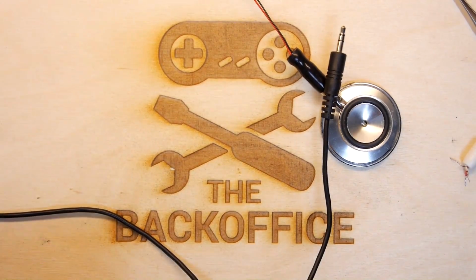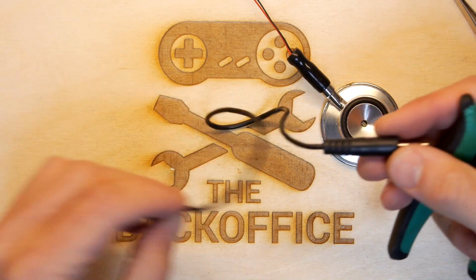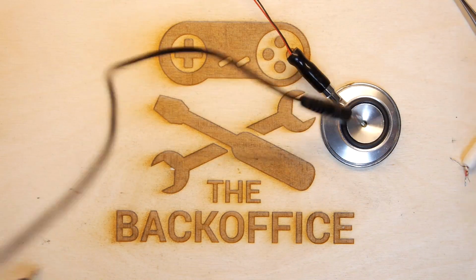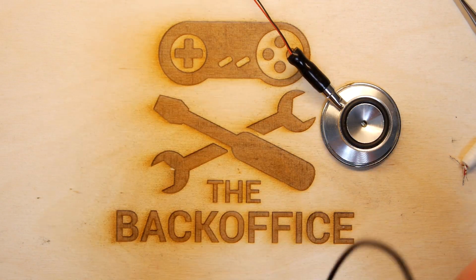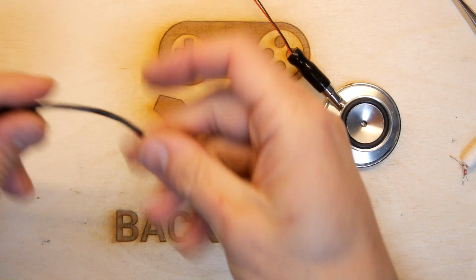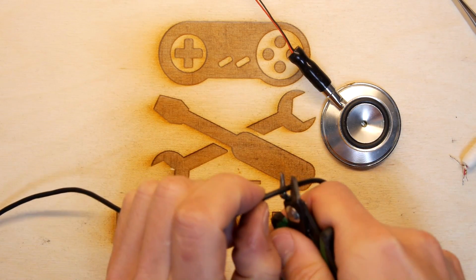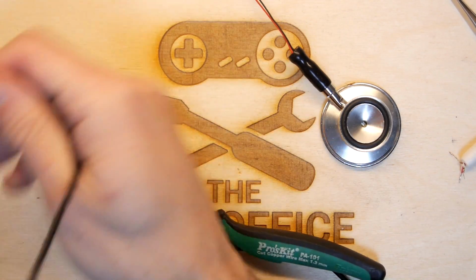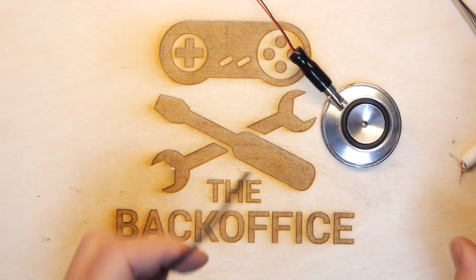Get my side cutters. In fact, I'm going to cut this one with a bit of a healthy length because I might want to reuse it. So if you've got this, I'm just going to take this cable out and measure it. It looks really long. Let's see how long it is. So to my reckoning, it's nearly 2 meters long. I don't really need this to be 2 meters long. So I'm going to cut off about 12 inches of that. So that's going to be another sort of audio project out of that. So put that aside. Won't need that for this project.